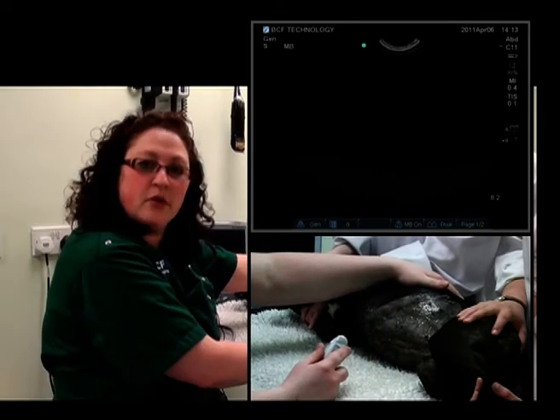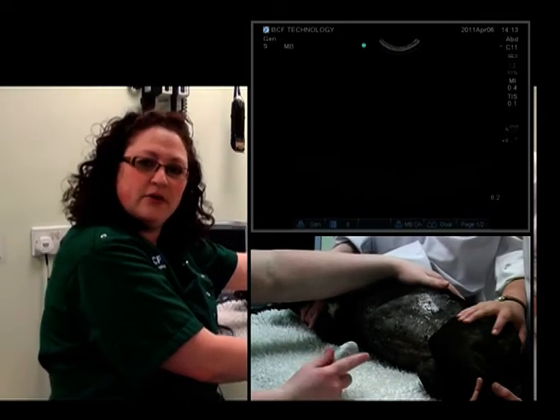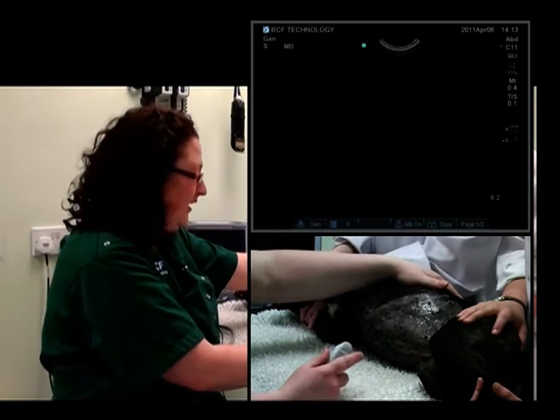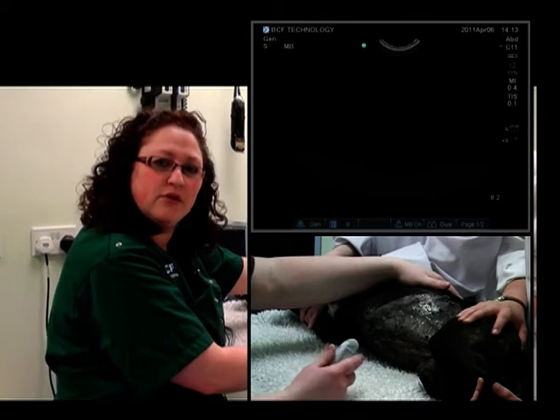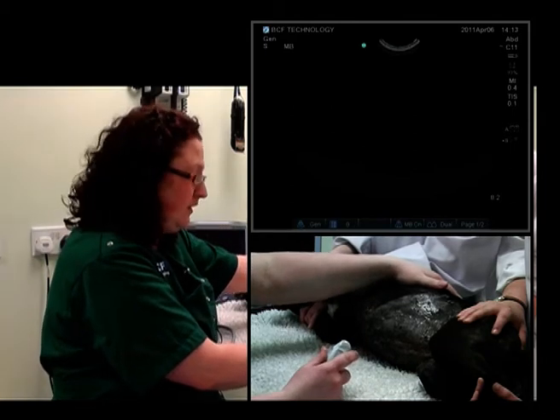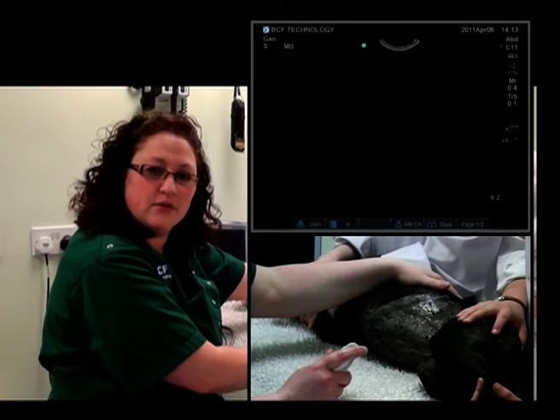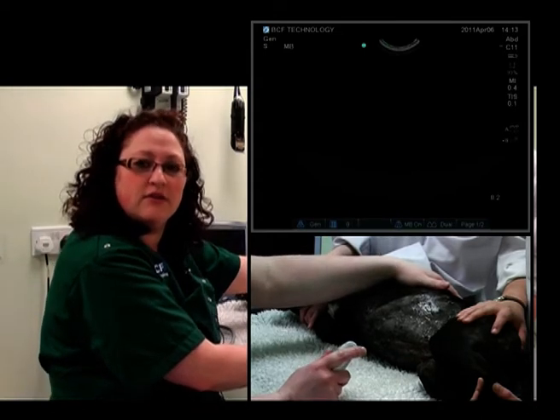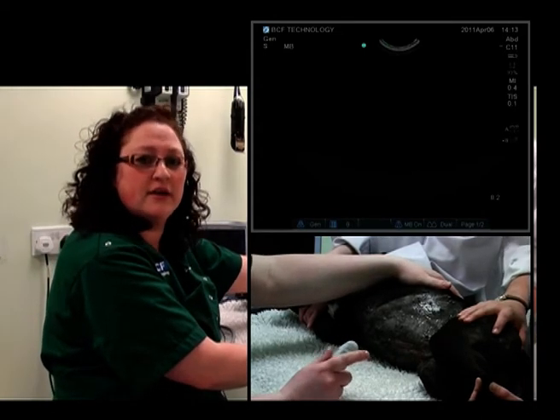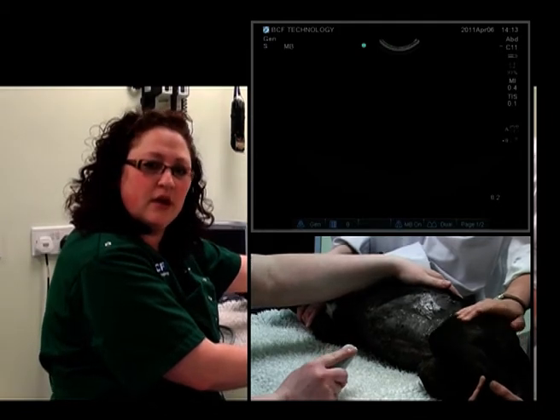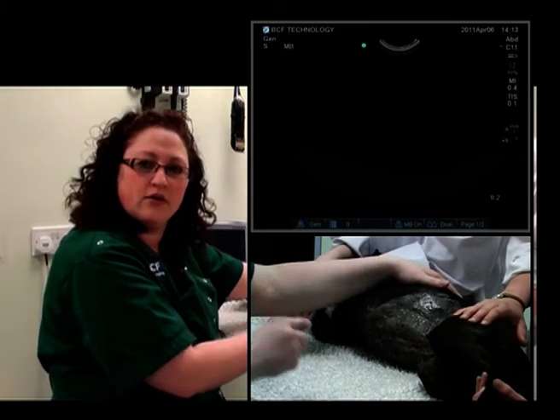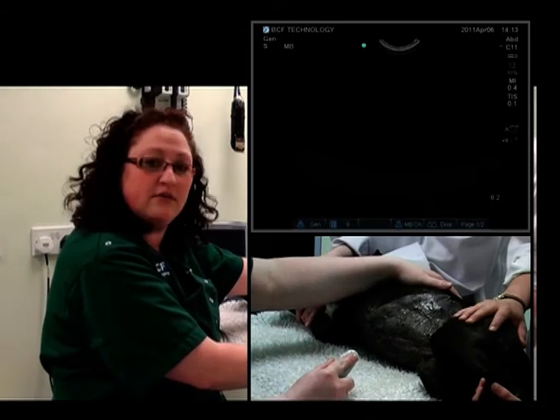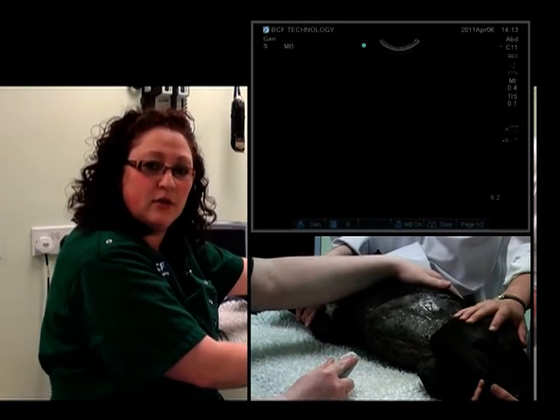We'll move on to the small intestine. The best way to evaluate the small intestine is not to go through every single loop — that would take quite a while. So what we'll actually do is get a general overview. One of the methods is using a technique very similar to the way a microscope slide is evaluated: starting at the level of the stomach, going up, down, and across, then repeating that caudally throughout the entirety of the abdomen.